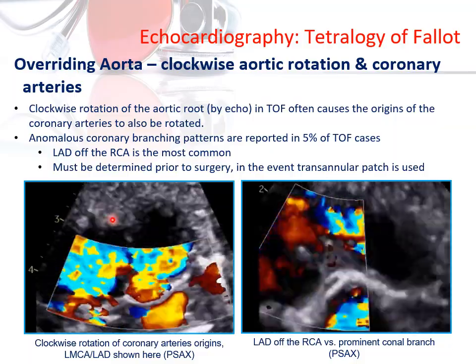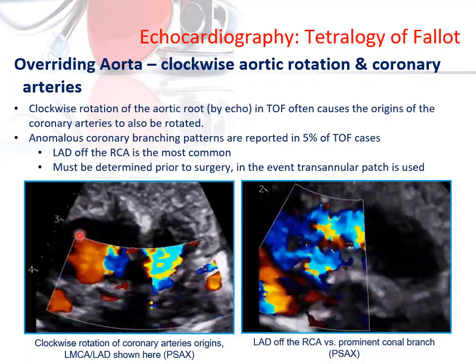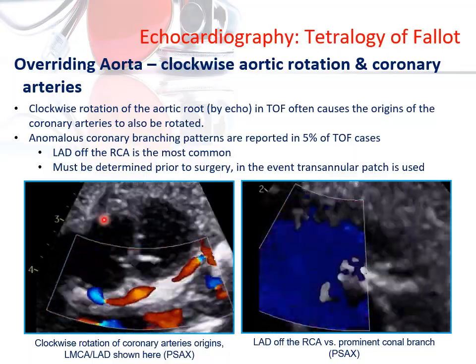Now the same would be true for the RCA. We just don't have the color box up here. We would expect it to be coming off somewhere around here. Again, because of that rotation, it most likely will be coming off somewhere in this neighborhood.